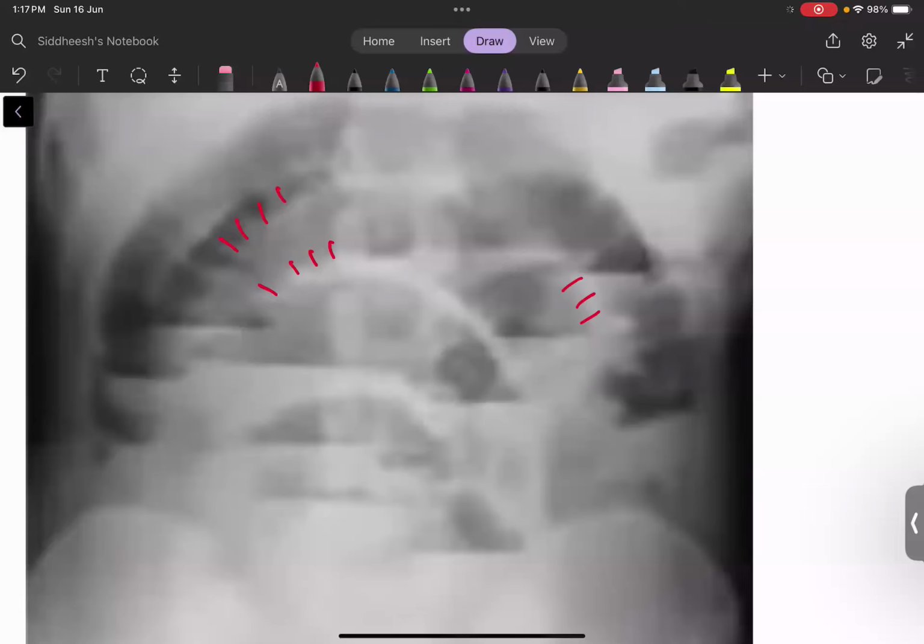Bhavnish, we are coming to that part. Don't worry. I will show you all the possible images. But as of now, please focus on the current images that we are discussing.